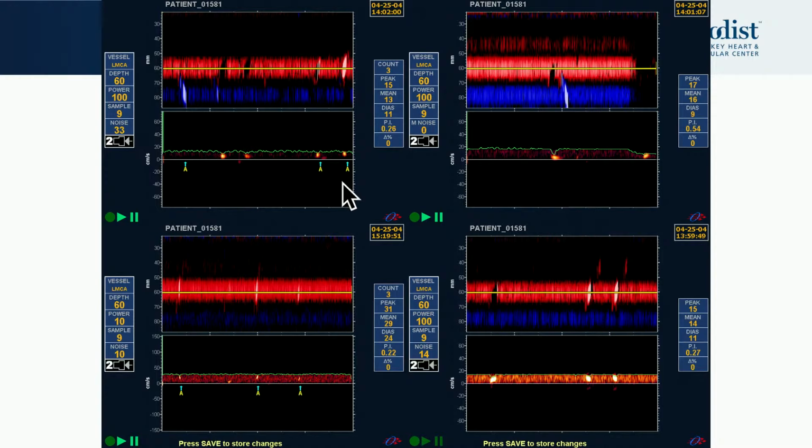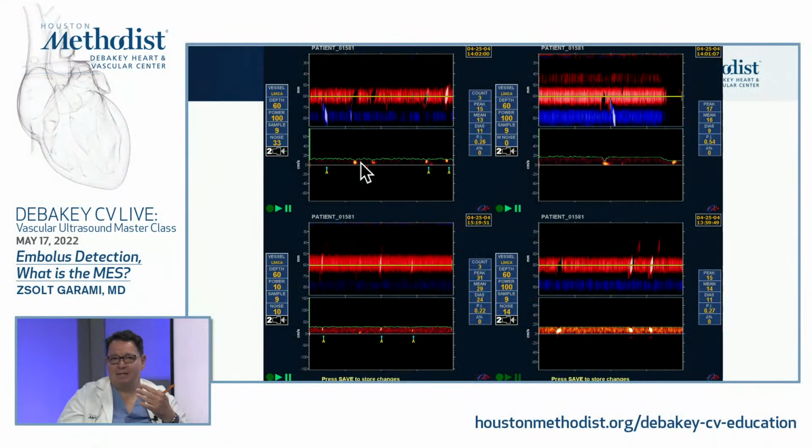These are the microemboli. So my microemboli signatures still remain white on the M-mode, while you have black ones. Those are the microemboli signal, and what I'm hoping is that they are not altering the waveform. So my criteria for this microembolus signal to be risking an MCA occlusion is whether this signal is still flowing. So when you see that it's dipping down a little bit, it means that for a moment it's definitely decreased the blood flow going through that, so the speed of the flow is definitely altered in this waveform. While you have this microembolus signal traveling faster, there's no change on the waveform at all.